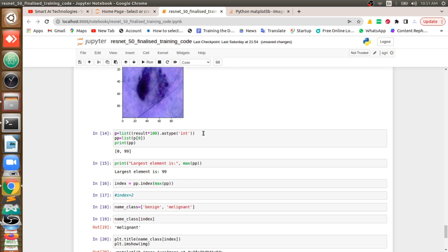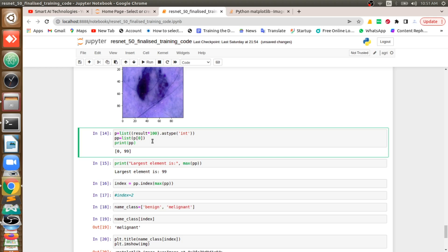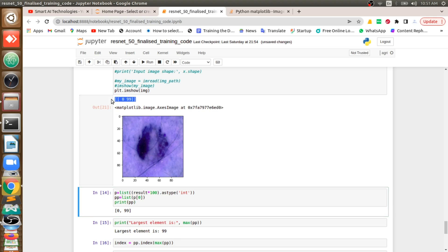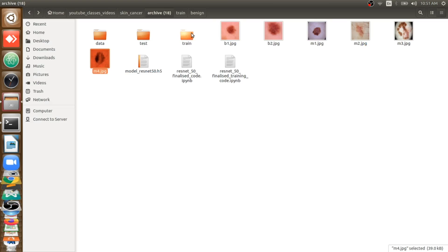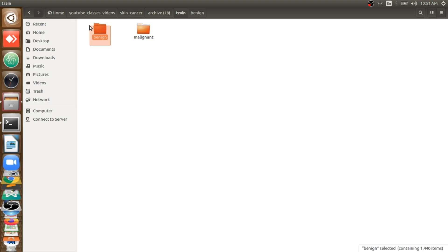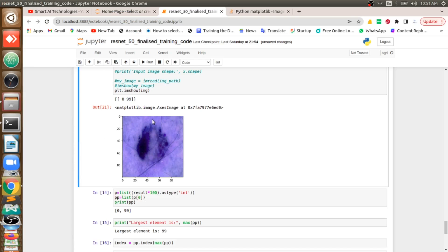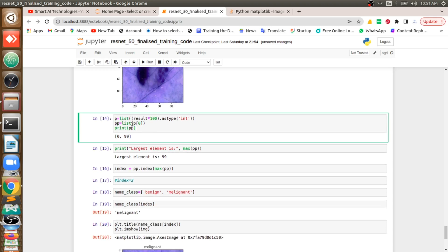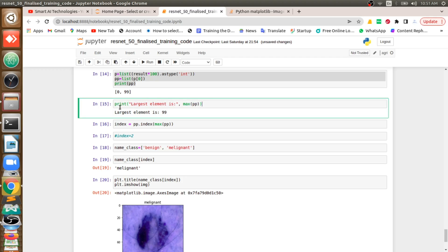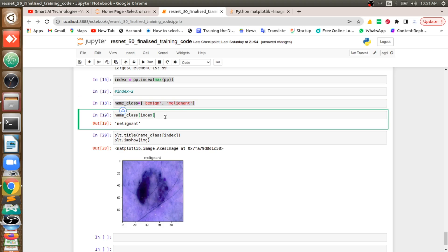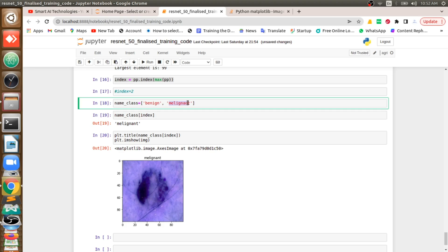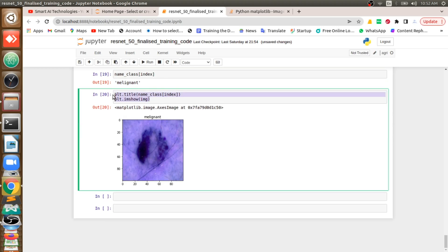I am using the saved model and loading the data to get the result. The result comes in array format — class 1 will be 0, class 2 is 99. In our dataset, class 2 is malignant and class 1 is benign. Since the image is malignant, I take the maximum value from that array, get its index, and compare it with the class list. If it's the second one it will be malignant; if it's the first, it will be benign. The final output prints as the title.